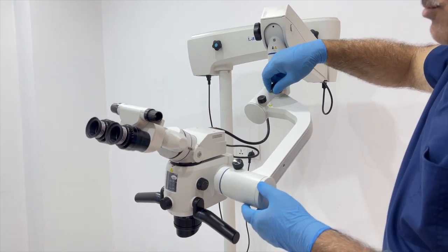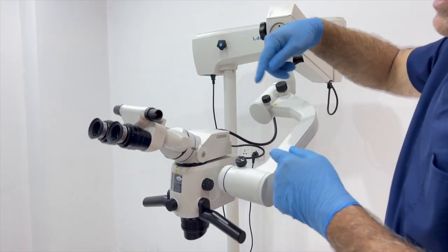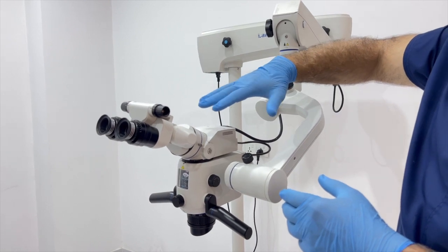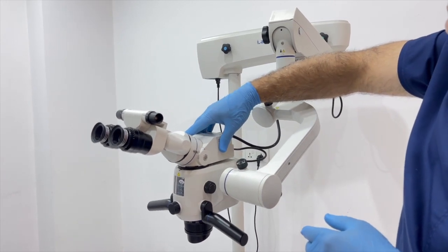So why would they do that? Just to make the head of the microscope balanced in case we are putting on a camera, an external camera, or a mobile, so the weight will change for the head of the microscope. So by this screw, we can balance the head of the microscope laterally.